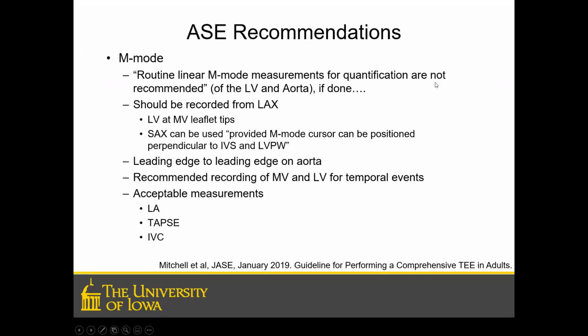Okay, so here's the first recommendation. It has to do with M mode. So routine linear M mode measurements for quantification are not recommended as published in this paper. If they are done, it is noted that they should be done from the long axis. And that's so that you can show that the M mode cursor is going through the minor axis of the LV.